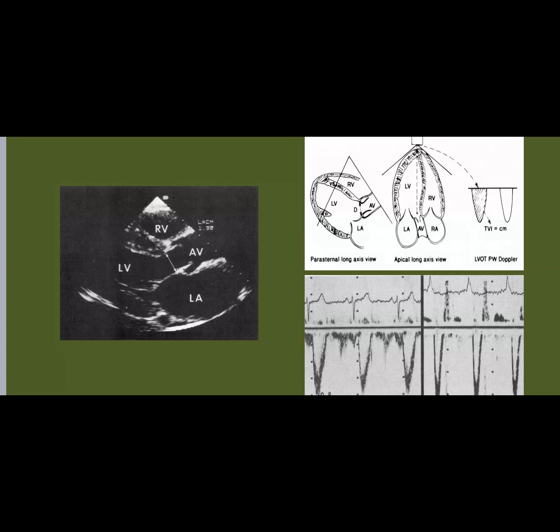In patients, we see so many patients, and maybe you have seen many, with an ejection fraction of say 25-30%, but they are doing so fine. They are living a happy, normal life. Others have an ejection fraction of 60 and they are extremely short of breath. So probably the ejection fraction does not reflect the exact functionality of the systolic function of the LV, and stroke volume is a better surrogate of that. Therefore, measuring the stroke volume is now part and parcel of any echo routine, not only the ejection fraction. You have to count the stroke volume.